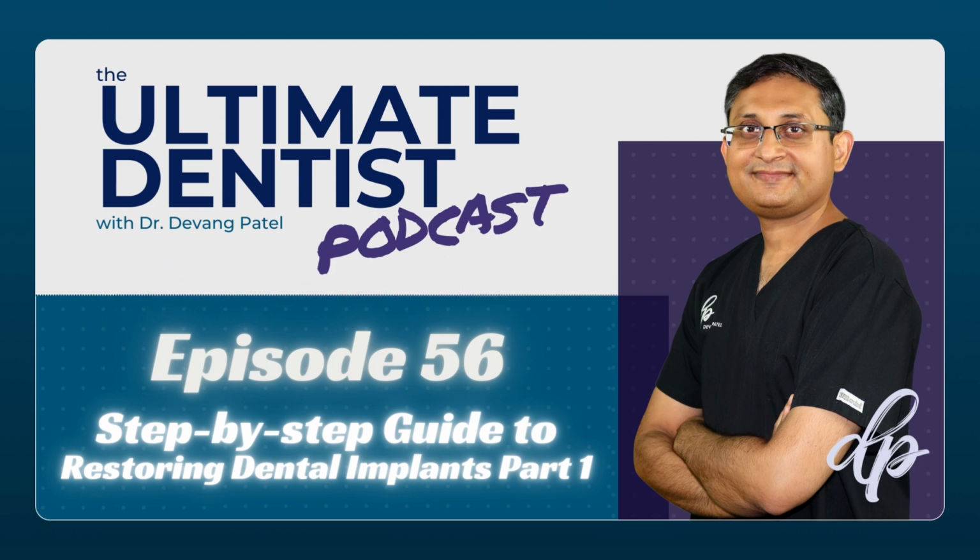Natural teeth can sink 25 to 100 microns, whereas the implant will only sink maybe 3 to 5 microns, and that's mainly because of the flexion of the bone. They don't sink in, it's just that the bone flexes and you see a little bit of movement. That's really important when you are checking occlusion, and we will discuss that when we discuss the implant fitting appointment.